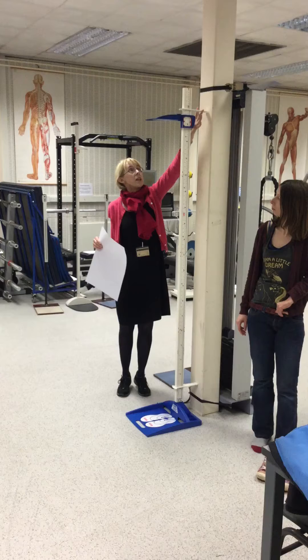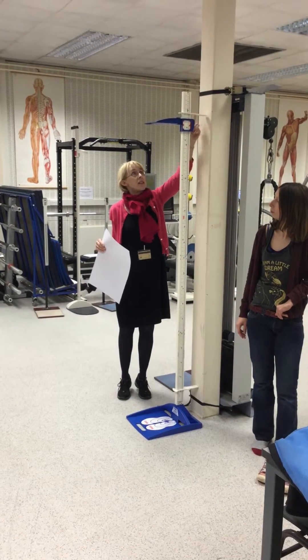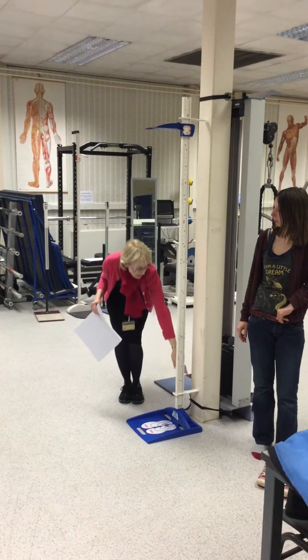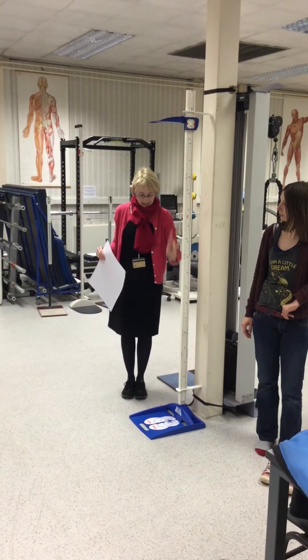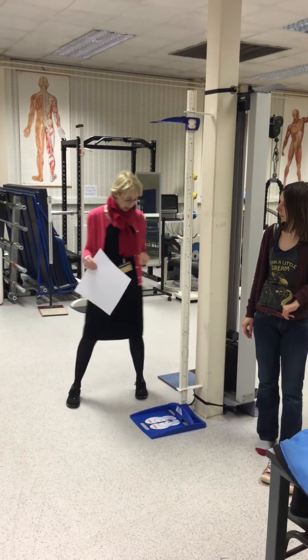The other thing just to point out is it has stabilisers on it at the top and down the bottom, and these have been positioned correctly so that the measure is exactly at 90 degrees to the floor. So we're quite happy that's okay.